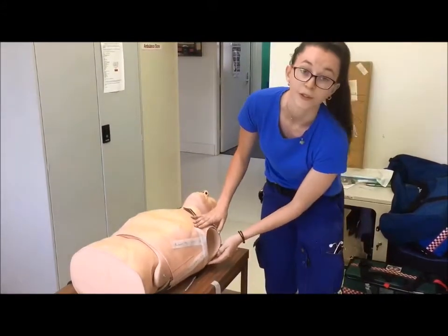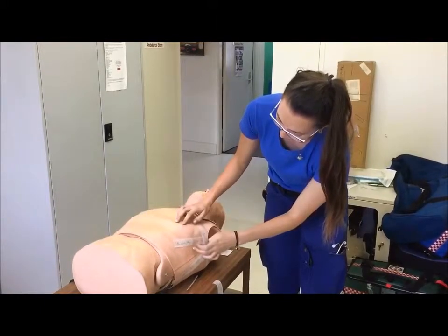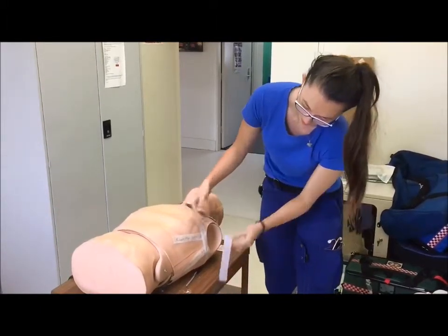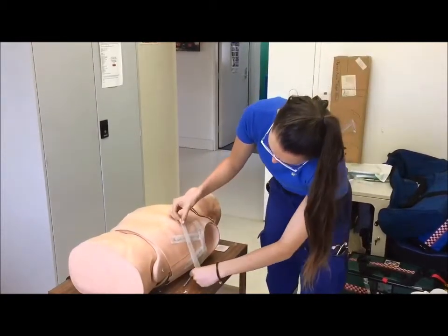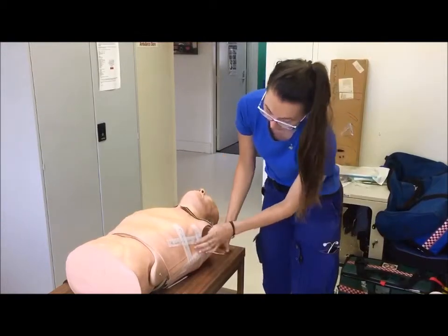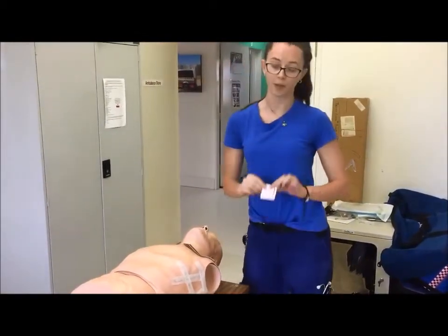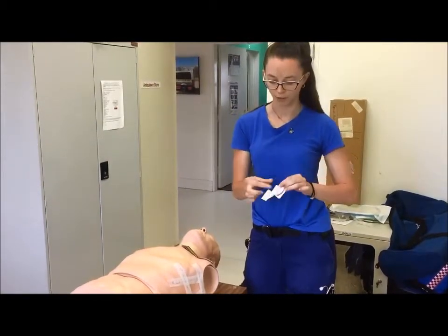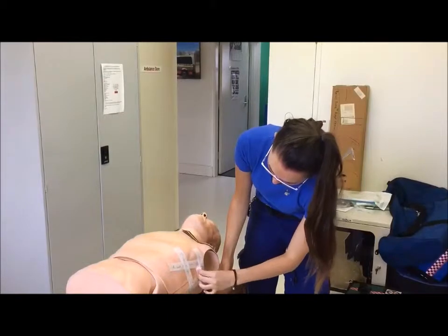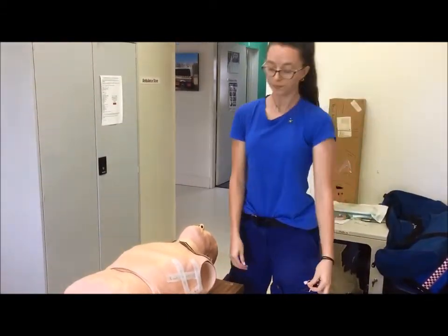And finally, we want the fifth intercostal space in line with the inferior nipple in males and the mammary fold in females. This gives us our area. Next, we use our skin prep. In this case, I'll just use a gauze swab, and clean the area in a back and forth motion. We allow this to dry naturally.